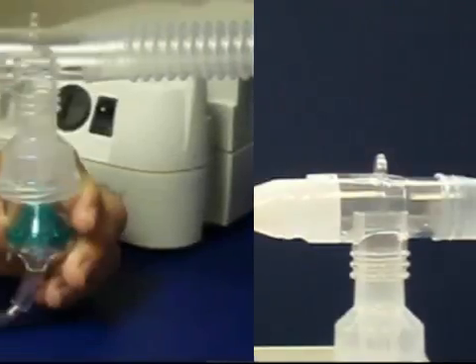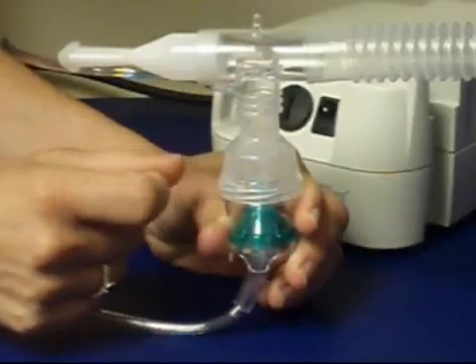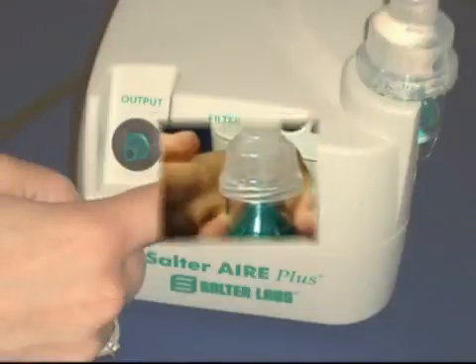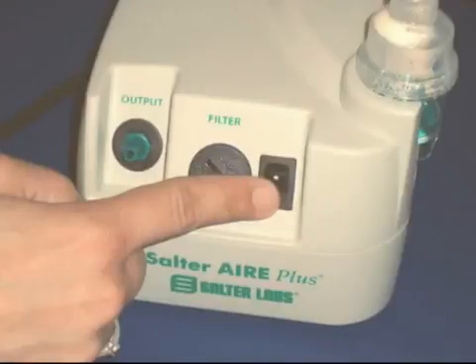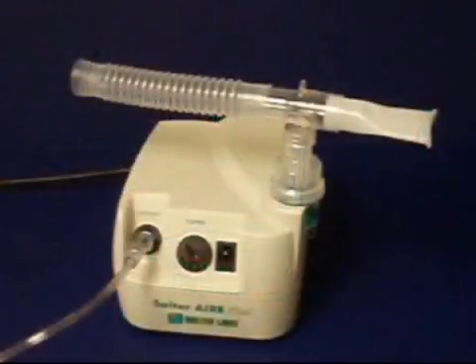It might be helpful to tap on the side of the medication cup once or twice to ensure that all of the medication is utilized. When finished, turn off your unit by pressing the rocker switch on the front of the compressor and return the nebulizer to the docking station.